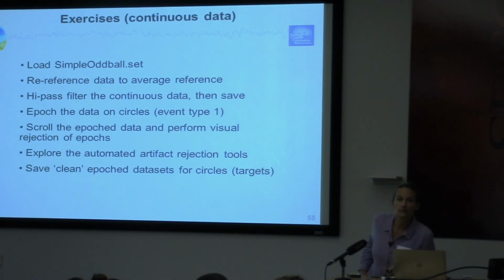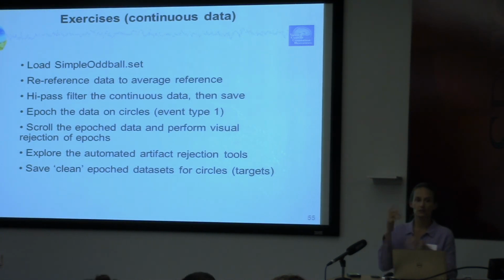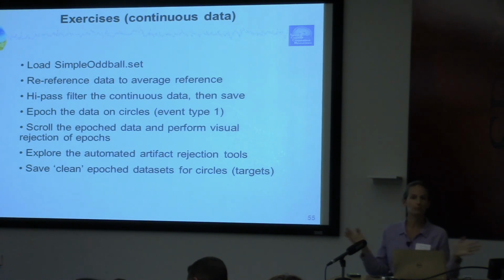Yeah. In the early step, when you high-pass filter the continuous data, you're still not running the ICA until after you've epoched the data. So ICA can be run on epoched or continuous data. And so it's just dependent on how you pre-process data. I'm going to show in the next lecture how to reject continuous data and run ICA after that. In practice, I actually epoch first because it's easier to run the auto rejection, but ICA doesn't care. It doesn't even know the order of the data.